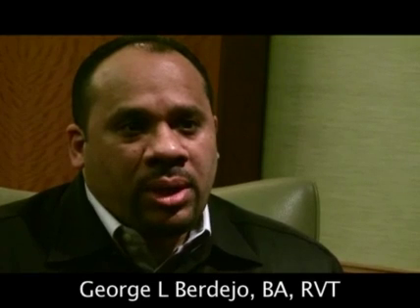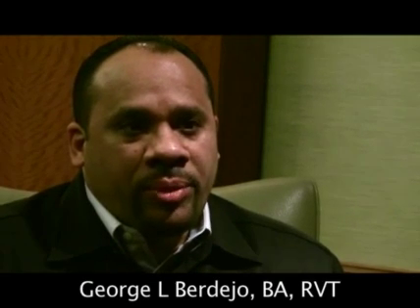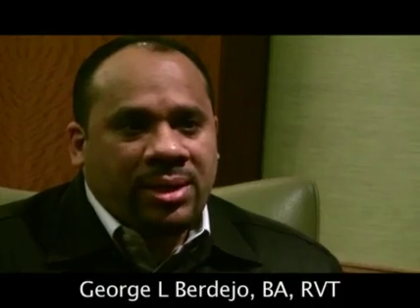Most of what I'll be talking about today has been extracted from the SVU procedure protocols and guidelines, which are available at www.svunet.org.